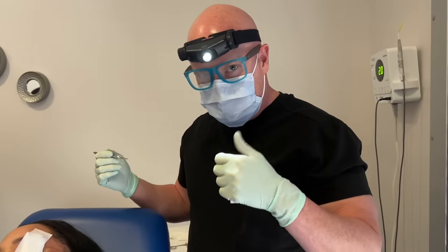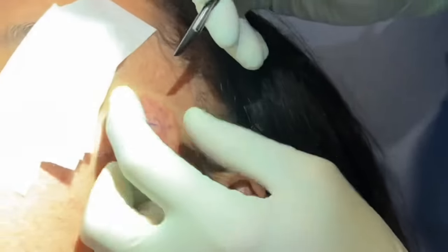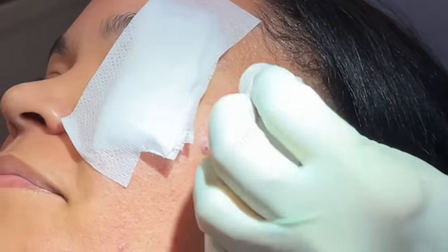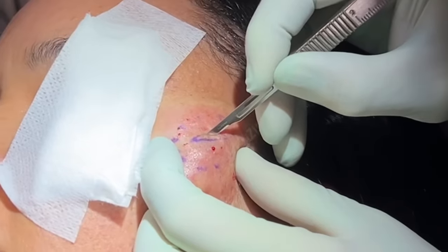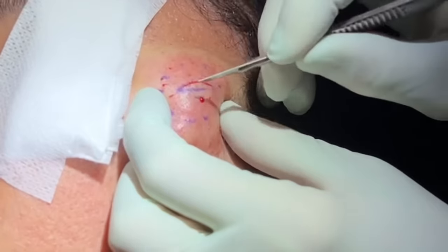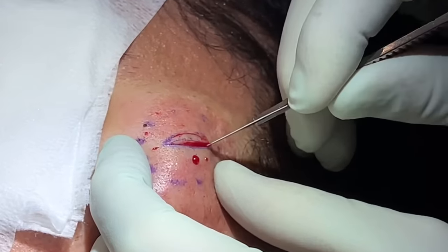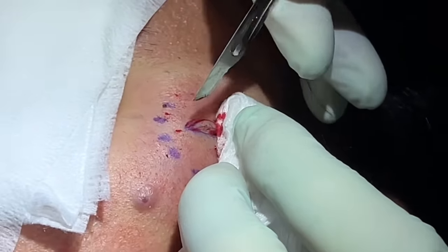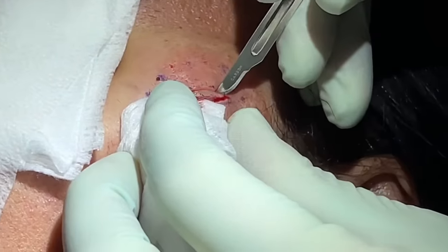Alright guys, we have her all ready and comfortably numb. All she'll feel is a little pressure and probably some heat from my light. I do a small ellipse and I get that pore in the middle — she has a little punctum there. I want to make sure to remove that so she doesn't have an enlarged pore sitting there later. Like we always do, we have a little skin handle at the top to help us pull up on the cyst.